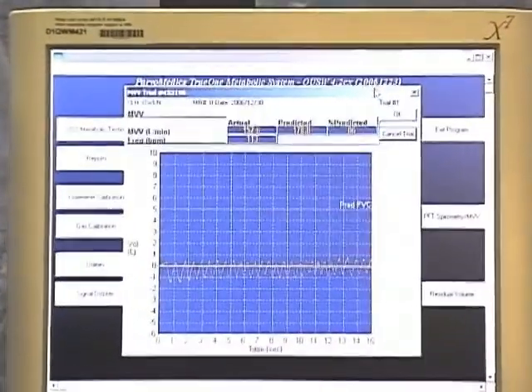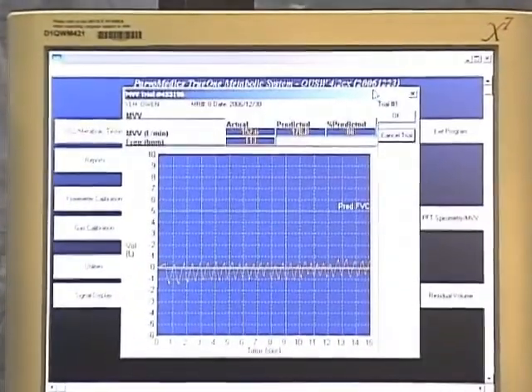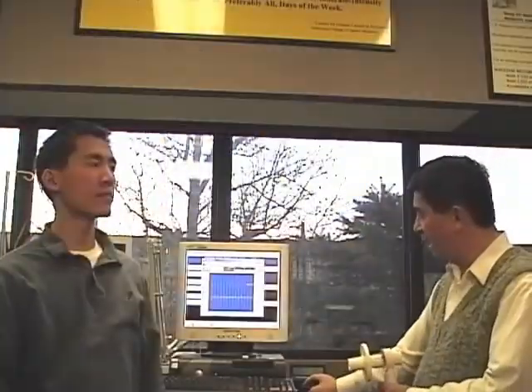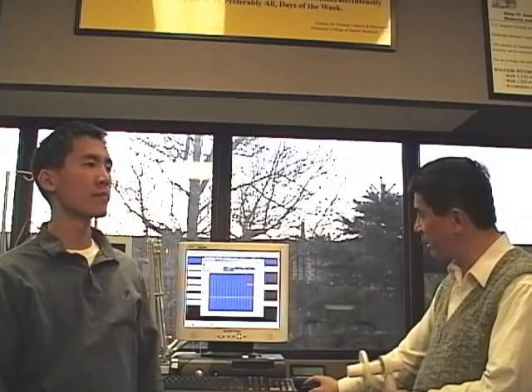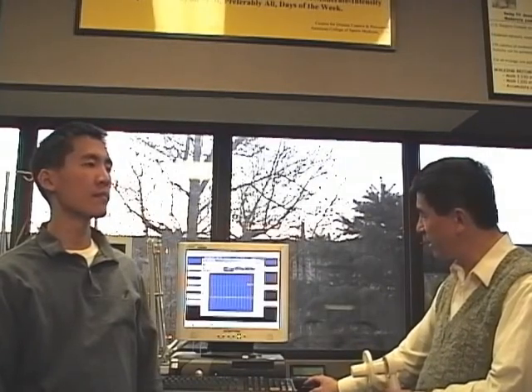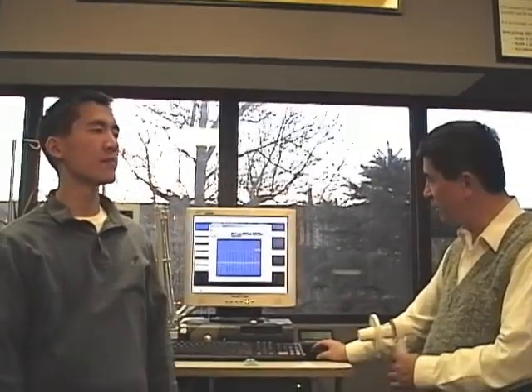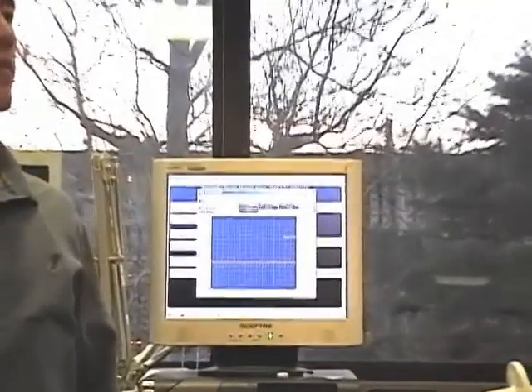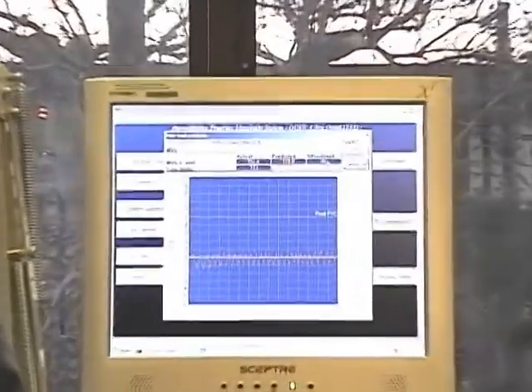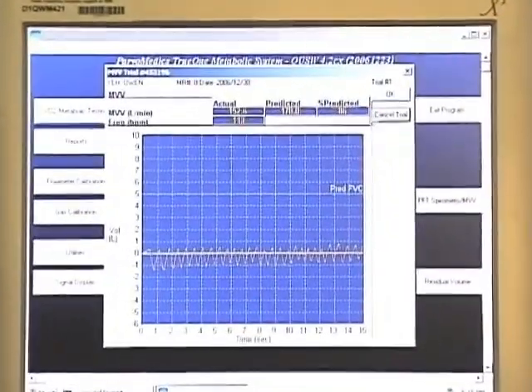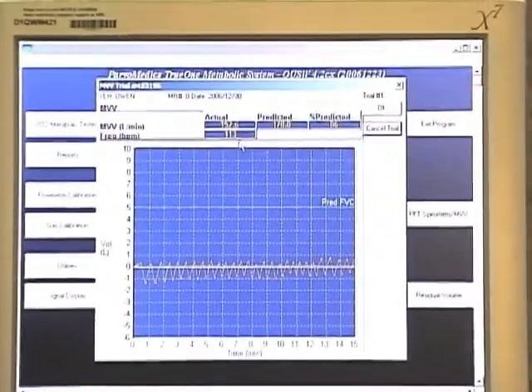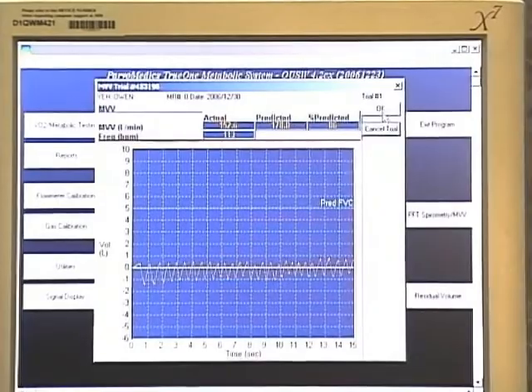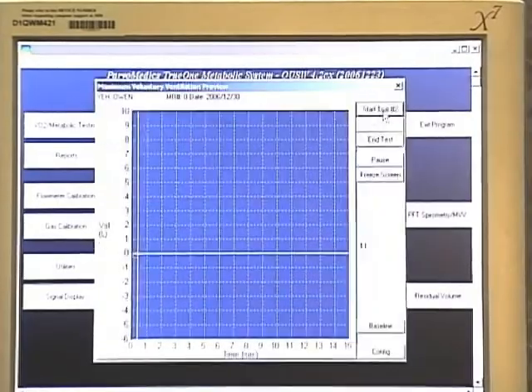Yeah, deeper, deeper — done! OK. So the last screen is the confirmation screen. In this case, it indicates that the subject has 86% of the predicted. And the frequency is 113. So we click OK.